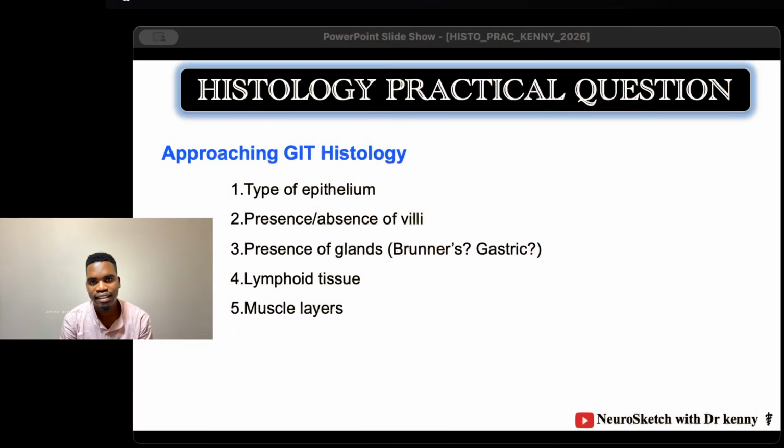Welcome to the Histology Practical Question Series, and today I have a set of techniques that are going to help you if you're going to approach the GIT histological examination question. These are the things you're going to put in mind. They will make it easy for you to identify the structure and name it in under a minute, because remember, given only one minute, you're asked to name the tissue and answer other questions that might be applicable.